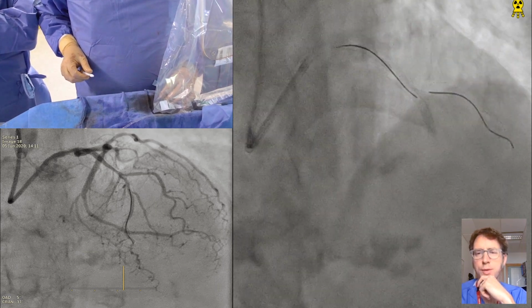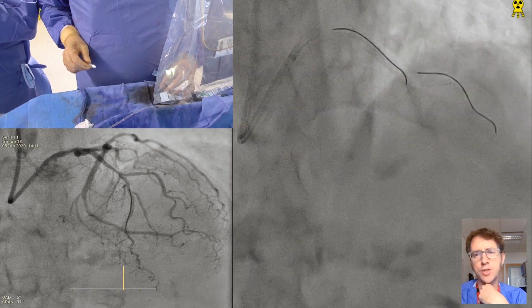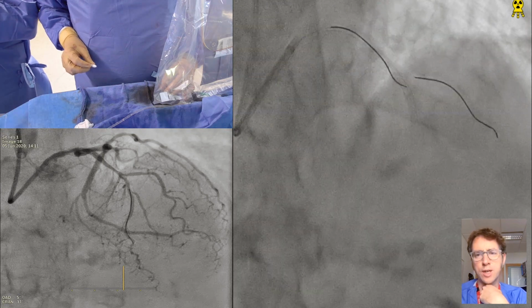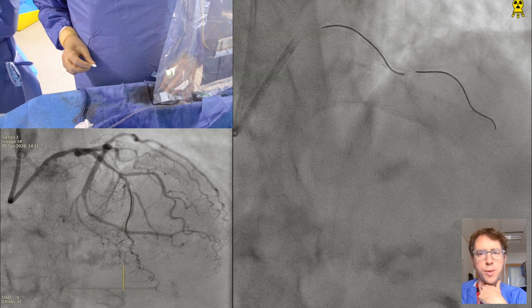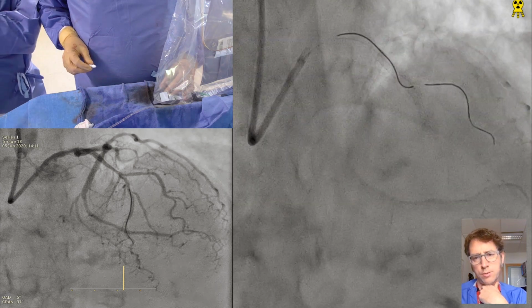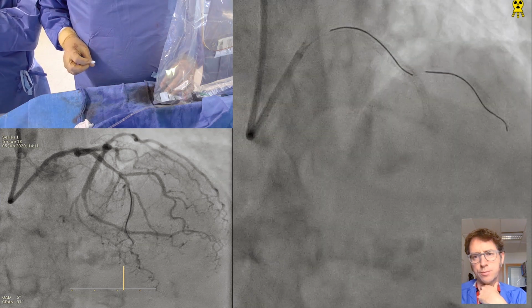And again, in theory, and perhaps we'll see this on the benchtop, the very open cell nature of this Ultimaster platform hopefully enhances that chance combined with the POT, but with just two linkers per rotation gives a very open cell structure.